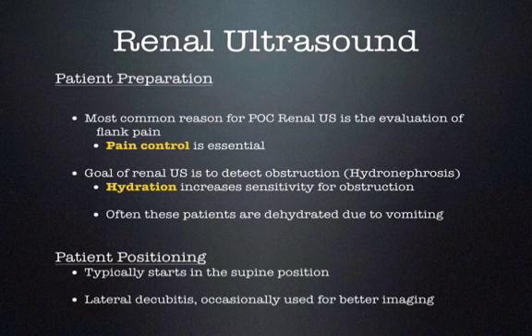As mentioned earlier, pain control prior to examination is essential for patient cooperation. Again, the main goal of point-of-care ultrasound is for the detection of hydronephrosis. Dehydration significantly decreases the sensitivity for the detection of hydronephrosis, and often the patients which we are scanning for hydronephrosis are dehydrated secondary to profound vomiting or diarrhea. Because of this, patients need to be adequately hydrated prior to performing the examination.